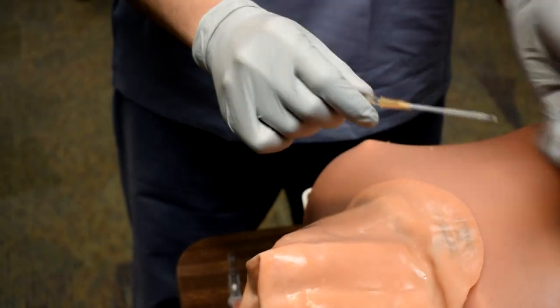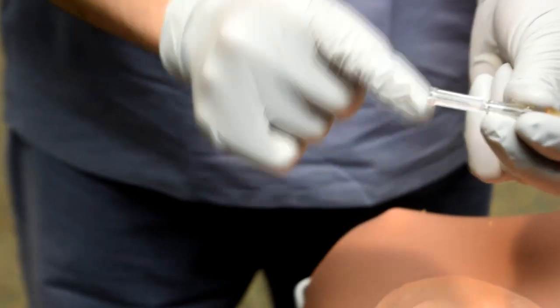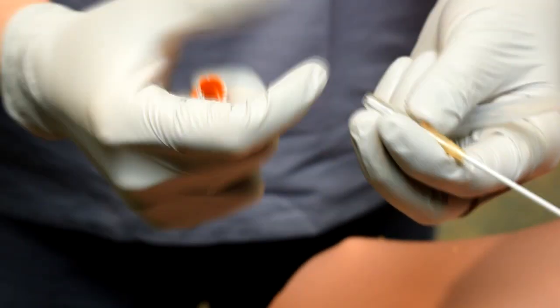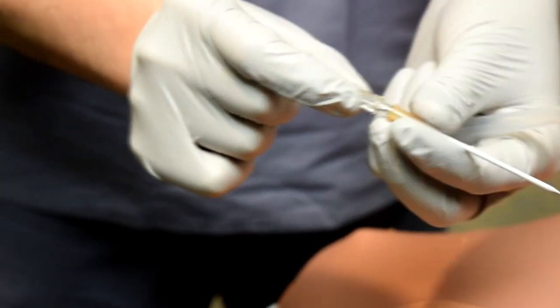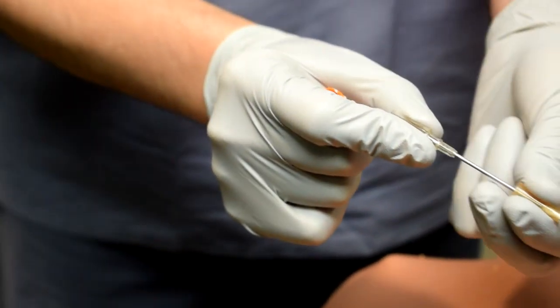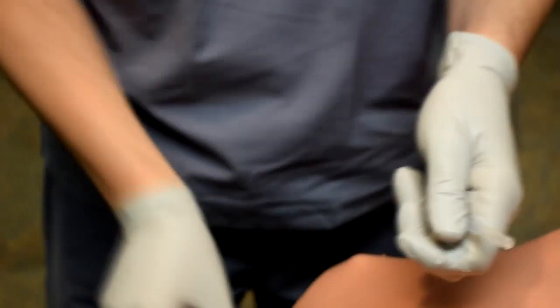And when you open it, you can see the angiocath on the needle, and it has this little adapter on the end, which you would want to remove so that you can attach a syringe to the end of this needle. And then you'll be able to pull back on the syringe and get back air to see that you're in the airway, and then be able to slide in with the angiocath. If you have a 14 gauge IV with an angiocath, this would be ideal.